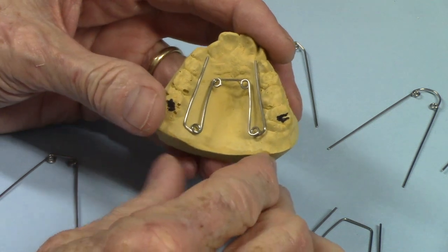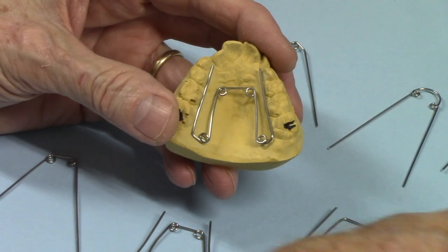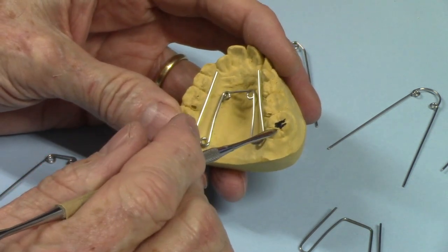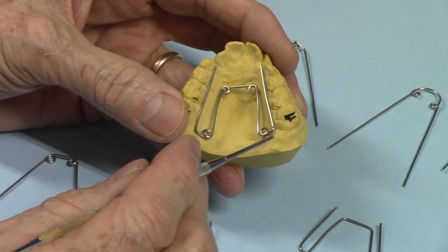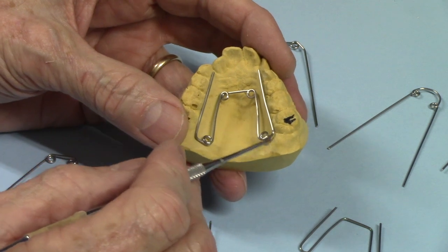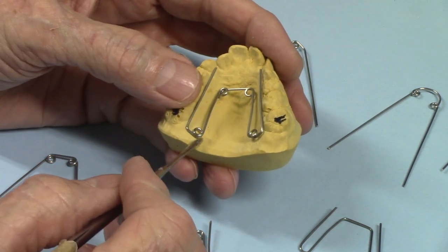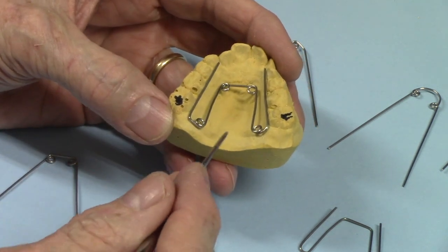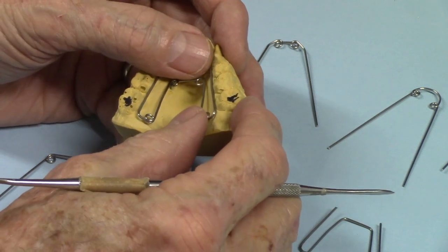Here's a quad helix appliance I'm going to be making for a doctor. They sent the bands along, and I'll be circumnavigating these six-year molars with a fissure burr to put the bands down. But I like to bend the wire before I do that so that I can see where the tissue is, so that I don't end up impinging on the tissue, because once I circumnavigate that I could destroy something tissue-wise that I need to make sure I'm not going to be impinging on.